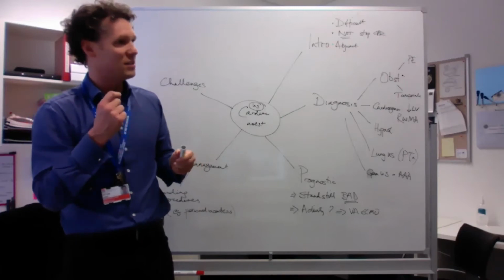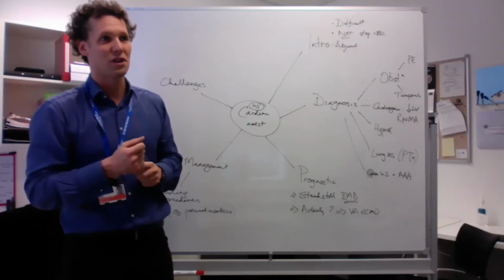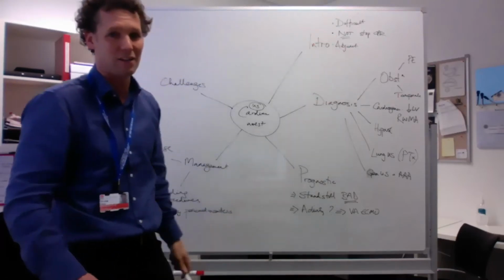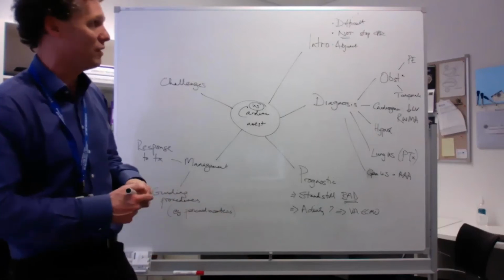You've got to answer the question and not miss out silly marks. Like, there's a mark just for saying don't stop doing CPR. Where do you put the probe? How do you do it?